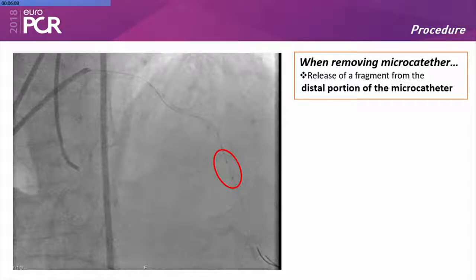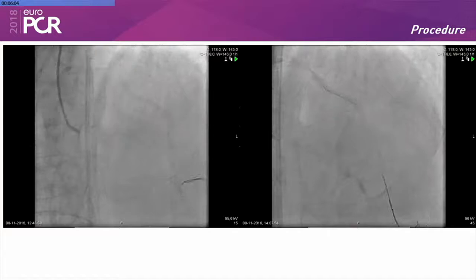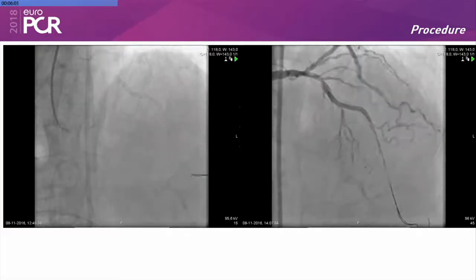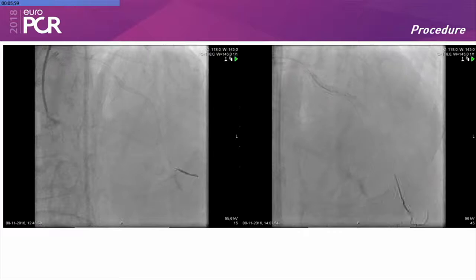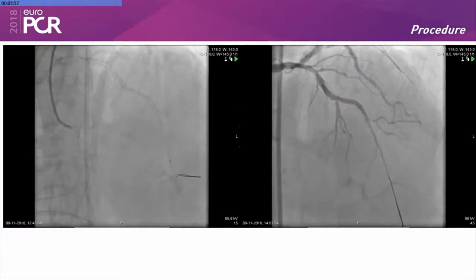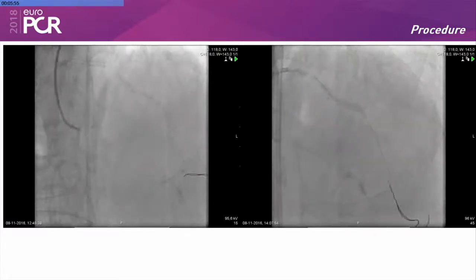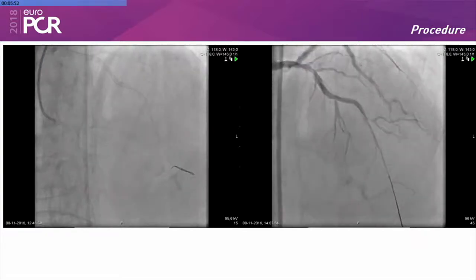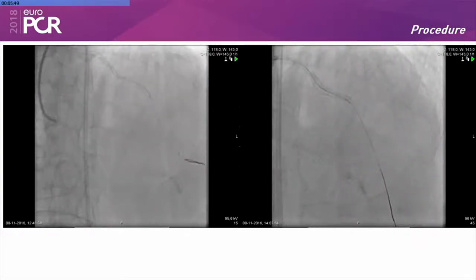So, how to solve this? We pushed the guide wire and advanced it into a distal diagonal, and using another microcatheter, pushed this fragment into the diagonal branch successfully.